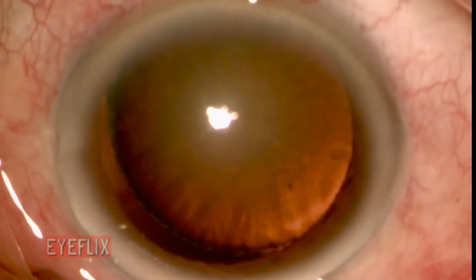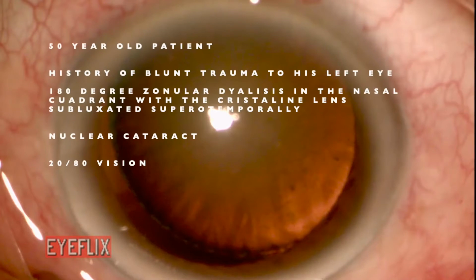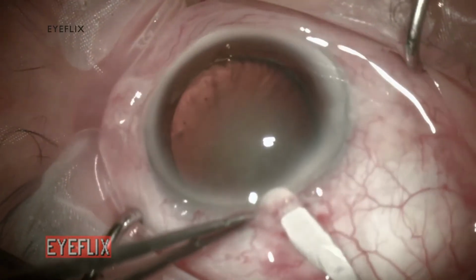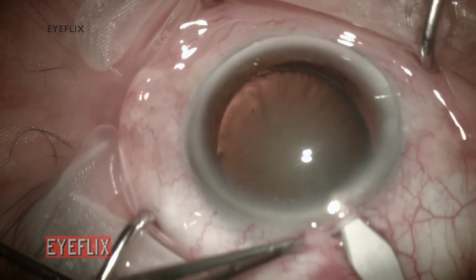This is a case of a 50-year-old patient with a history of blunt trauma to his left eye. He presented with 180-degree zonular dialysis with subluxated lens, a nuclear cataract, and 20/80 vision. I proceeded with a superior sclerocorneal incision.